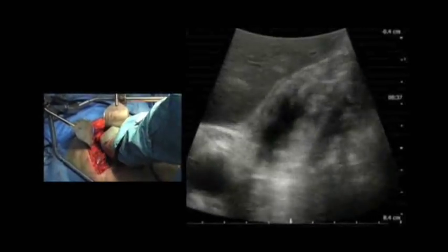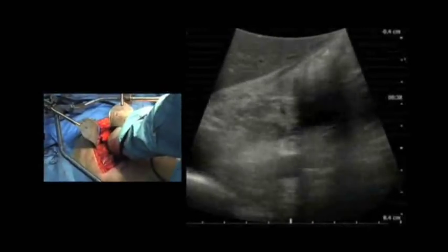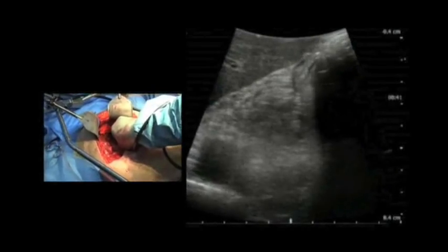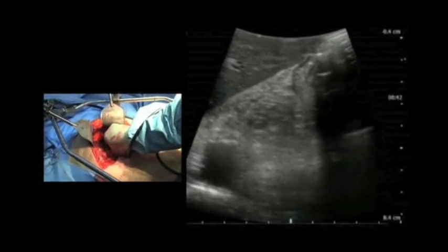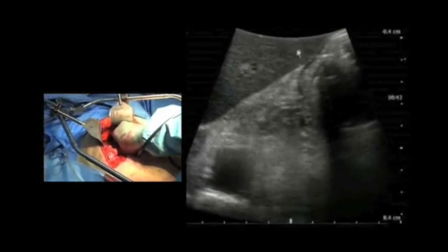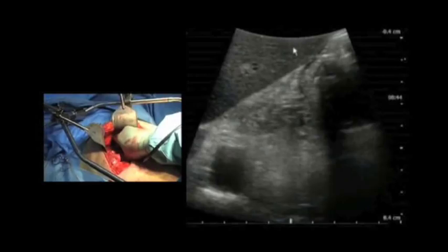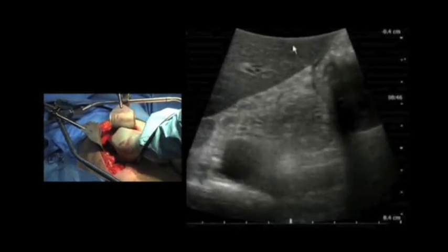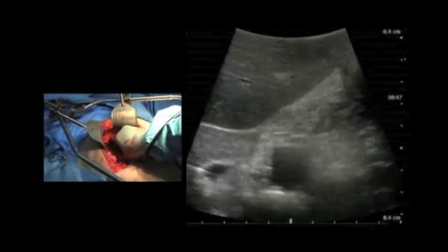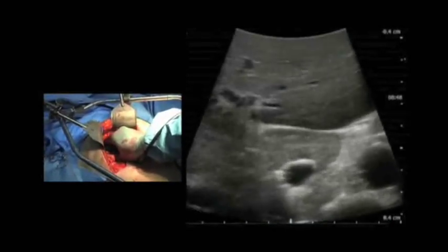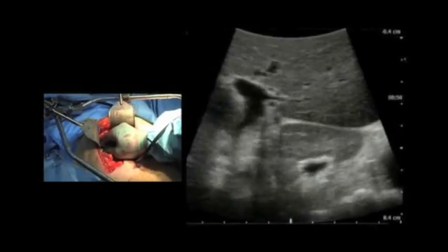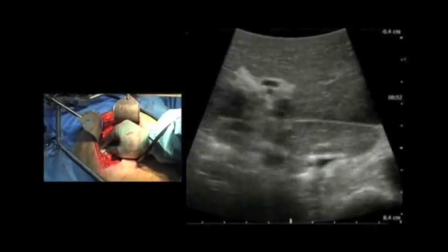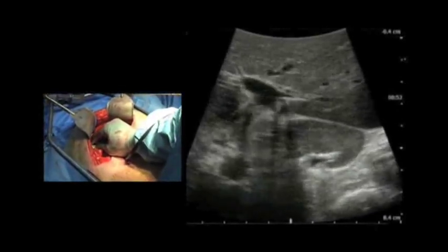If we go into the tip of the left liver lobe here, then we have this little mass, which we can see as a blurred area here, which we are going to end the procedure by taking a biopsy from. However, we will continue our search for other irregularities in the liver.